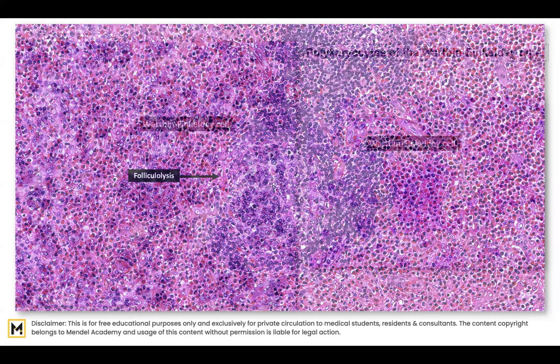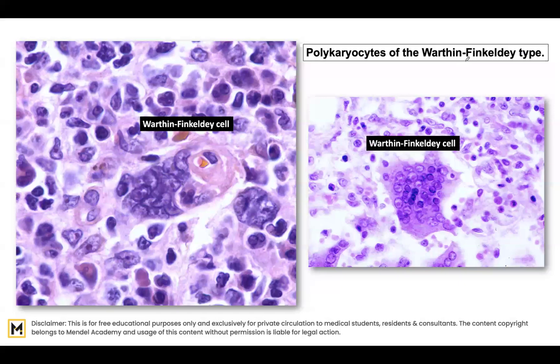The presence of polykaryocytes of the Warthin-Finkeldey type — essentially giant cells with numerous nuclei, sometimes ranging up to 30 to 40 within a single cell — are also seen in Kimura disease, located inside the germinal center.